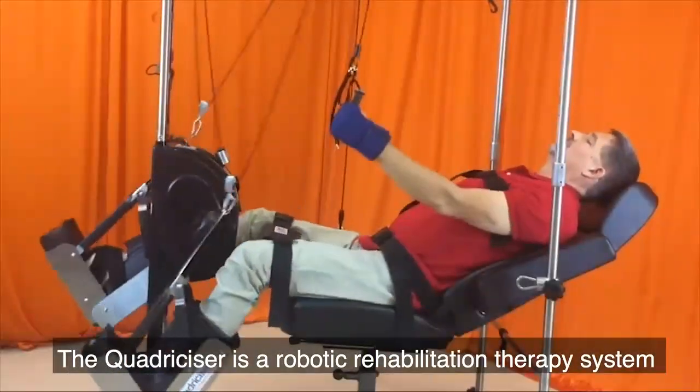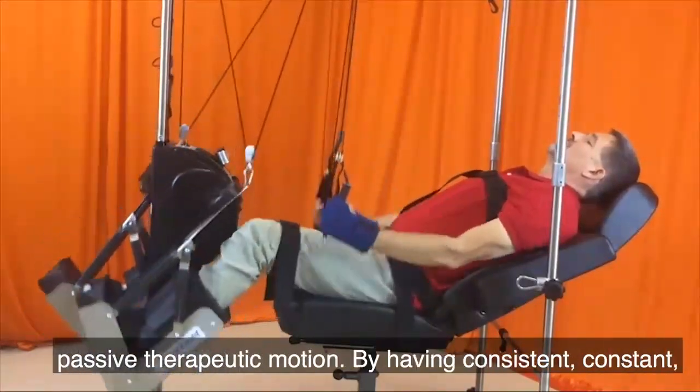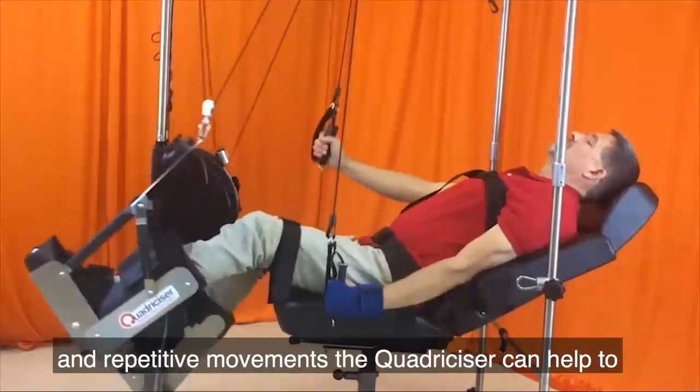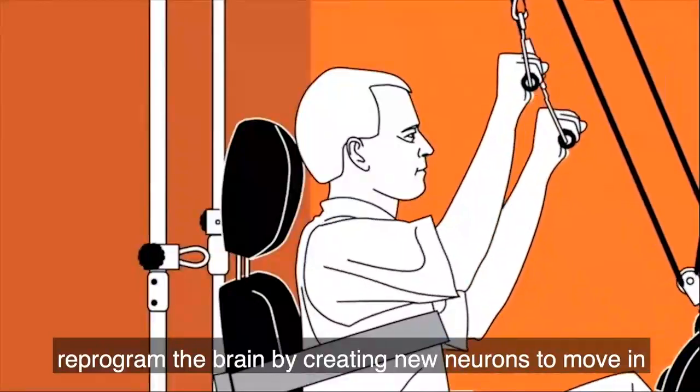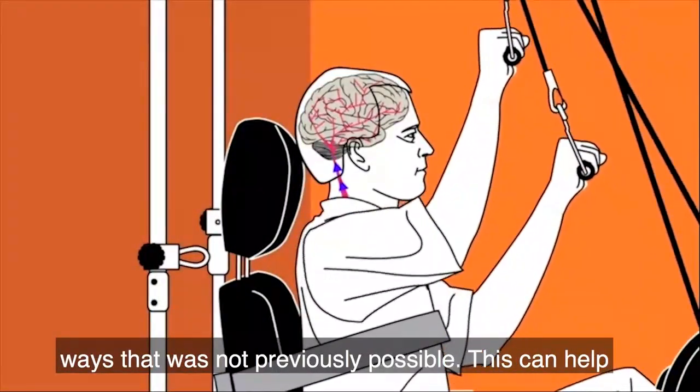The Quadricizer is a robotic rehabilitation therapy system that simultaneously moves all four limbs in an active or passive therapeutic motion. By having consistent, constant, and repetitive movements, the Quadricizer can help reprogram the brain by creating new neurons to move in ways that were not previously possible.